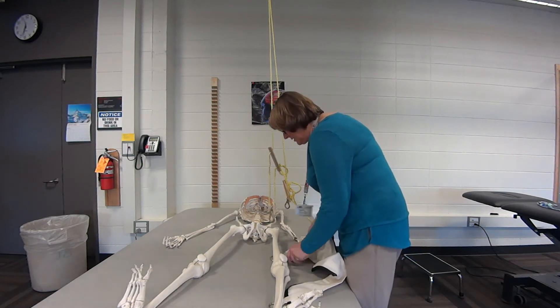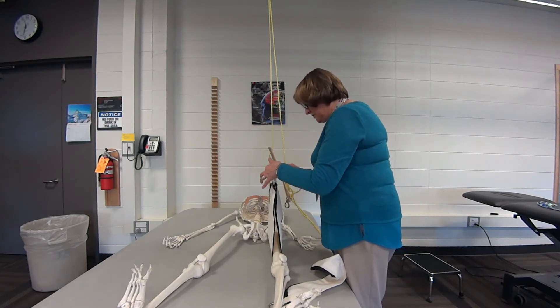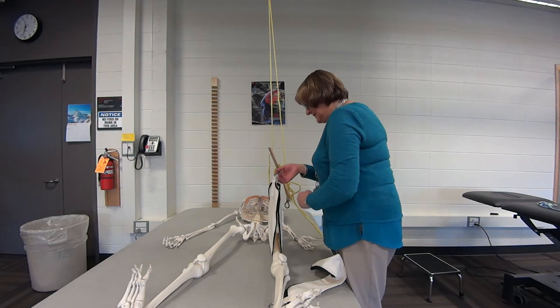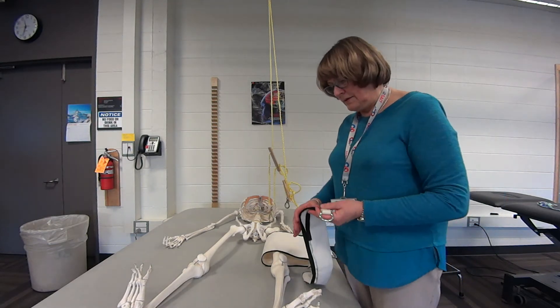Slide the sling underneath the thigh, and try to make sure that you've got equal length on both sides. Then position the sling on the foot.